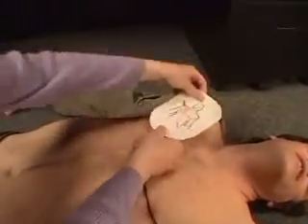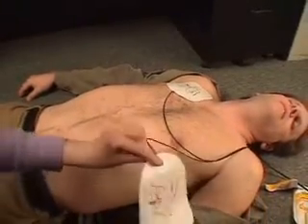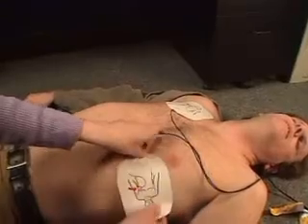Make sure the victim's chest is exposed and dry. If needed, shave the victim's chest hair. Place the pads on the victim's chest according to the diagrams on the pads. Apply pads.